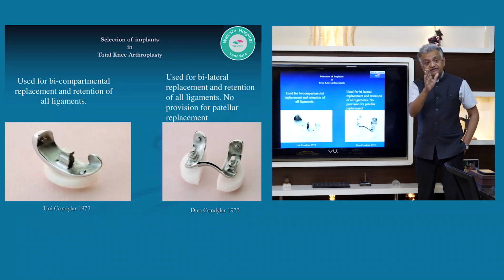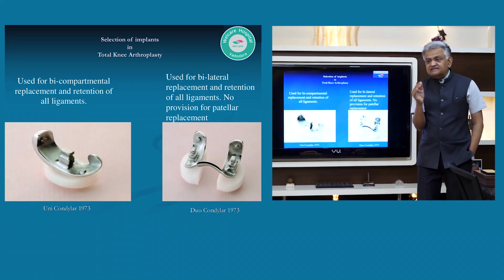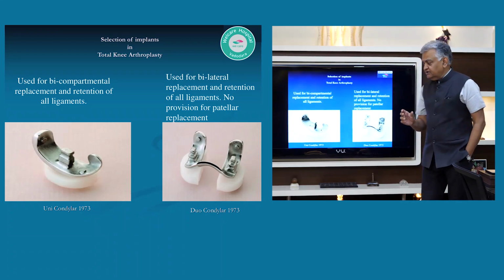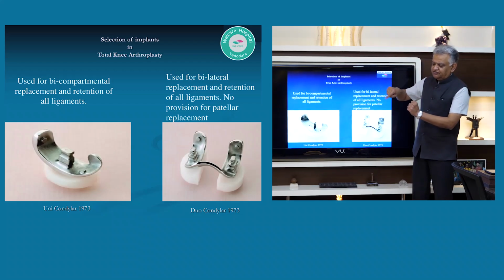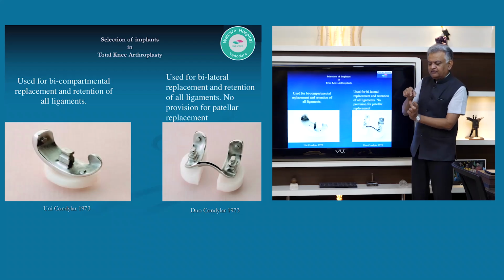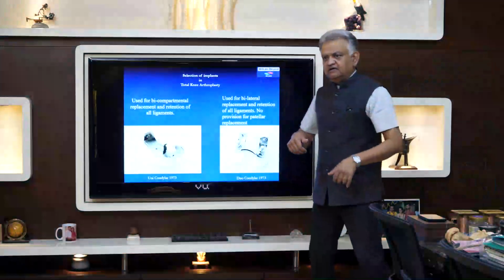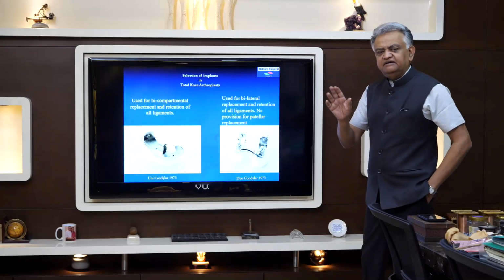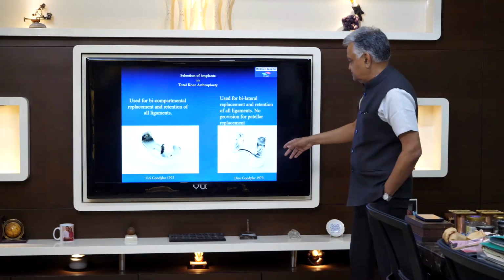In the late 50s through the 60s, things such as the Gunston knee were also similar types of unicondylar concepts, like a small strip of metal sitting on the femoral condyle and a grooved rail-like piece sitting on the tibia. So these were the Gunston knees, unicondylars, and similarly McKeever, Gunston. These are names, but that's more about history, so I'm now skipping forward.